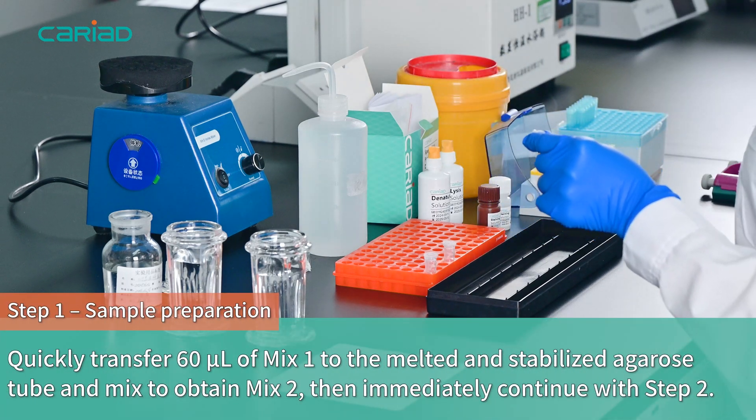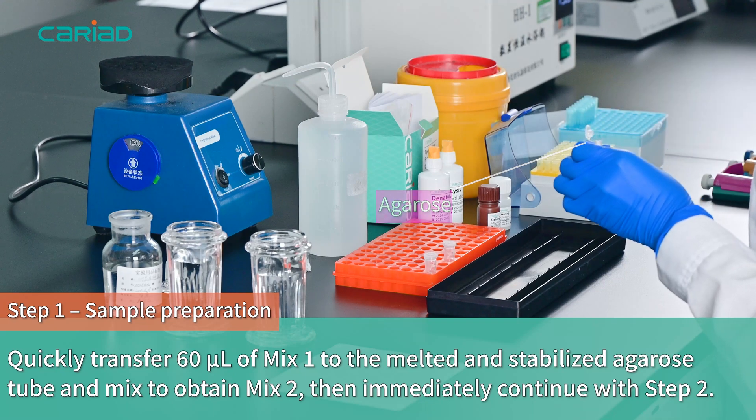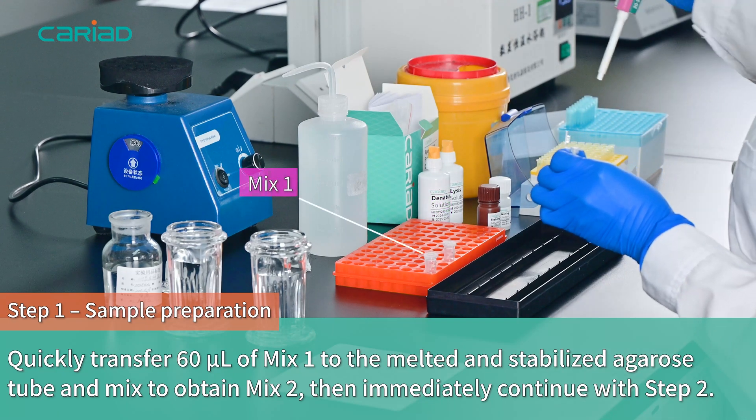Quickly transfer 60 microliters of Mix 1 to the melted and stabilized agarose tube and mix to obtain Mix 2, then immediately continue with Step 2.